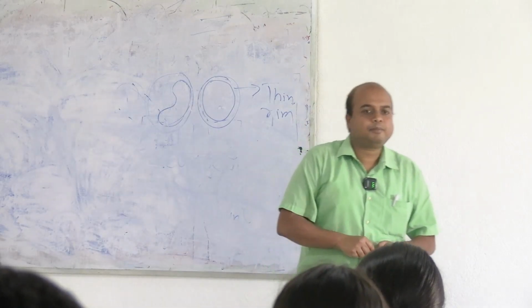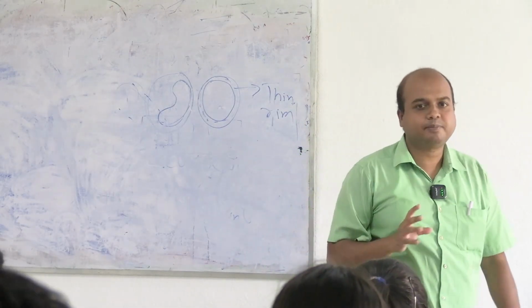The shape is also typical. It is bean shaped or kidney shaped and easy to identify, plus it is much larger in size than the RBCs and somewhat larger than the other WBCs also. So these types of WBCs you have to identify. Okay. Now after you have learned to identify the cells, you will have to count them and express it as a percentage of 100, which is the differential leukocyte count. So we will discuss how to count and take the result of the differential leukocyte count.